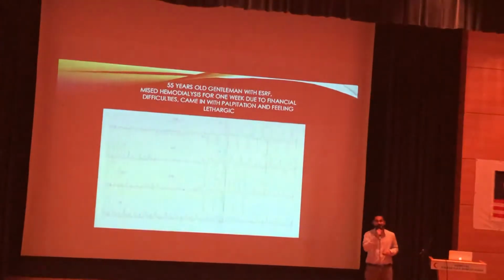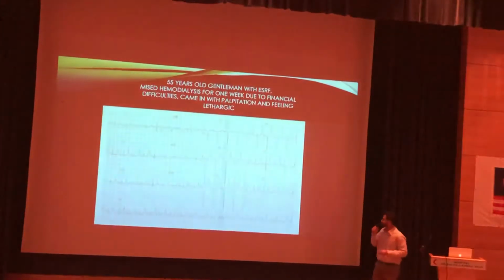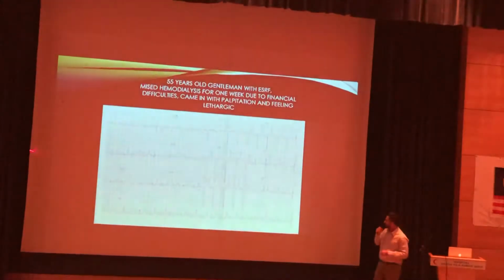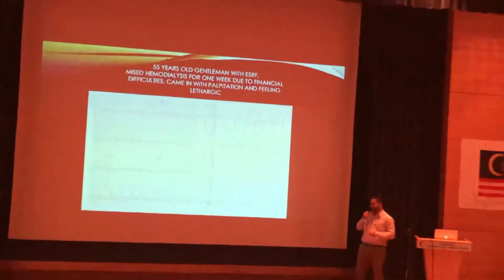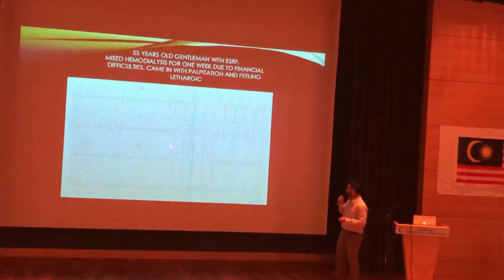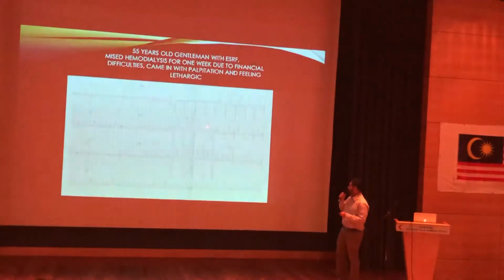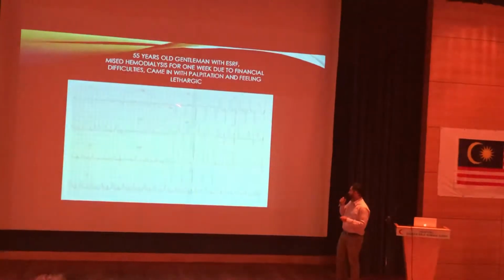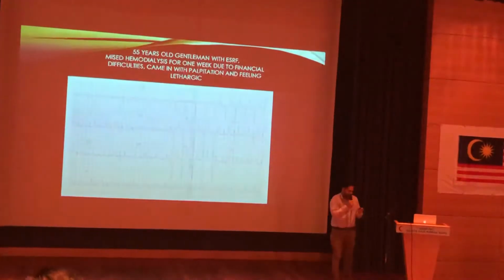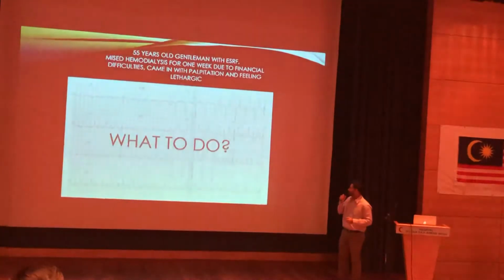You don't see anything. Yes, of course, we will dialyze first and go to our nephro counterparts. So, have a look at this. What do you all see? T wave? Yes, very, very tall T waves in most of the leads. So, what do you think? Spot diagnosis is? Come on. Hyperkalemia. Yes. So, what do you do?